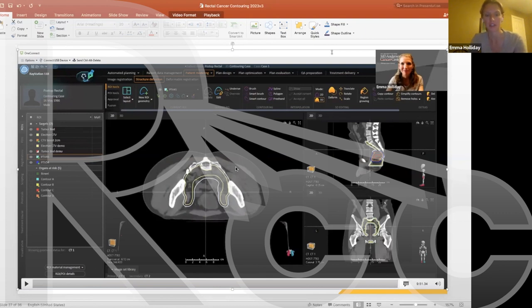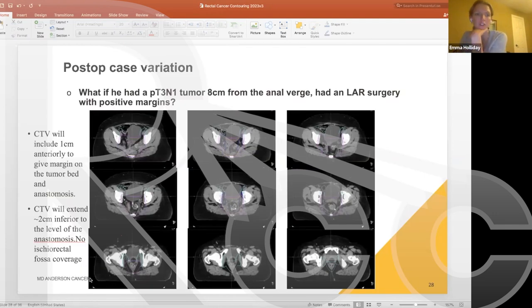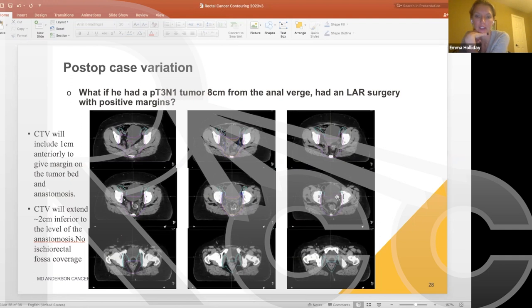Regarding a question from the chat about constraints on the colostomy bag: if it were in the field, I would try to keep hot spots over 45 Gy out of the ostomy. For a post-LAR variation where the patient had a low anterior resection instead of APR, we contour the area of the anastomosis using surgical clips to guide the target, with at least 1–2 cm of anterior margin. Rather than covering the ischio-rectal fossa down to the skin, the elective coverage stops at the pelvic floor, similar to the pre-operative case.